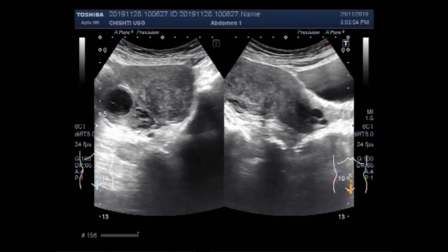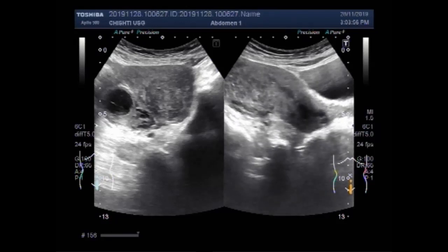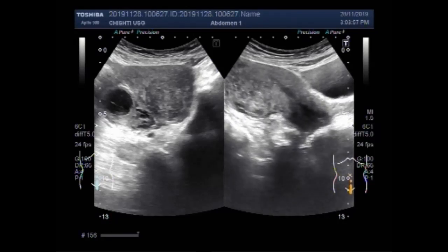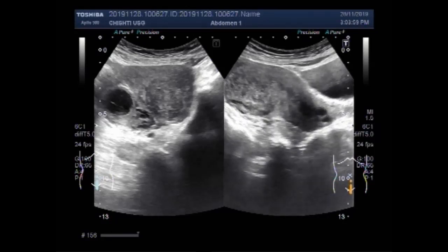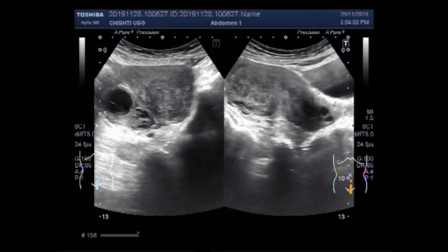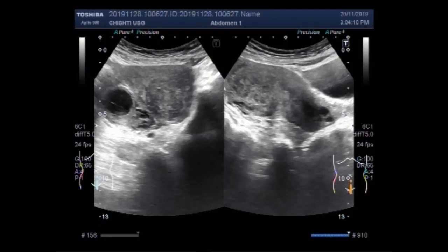Now a couple of cervical cysts are also seen along with the mass in the uterus. This is the fibroid. Now this is the mass in the uterus — fibroid.